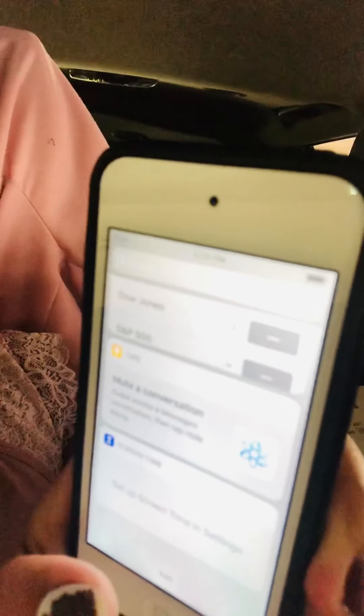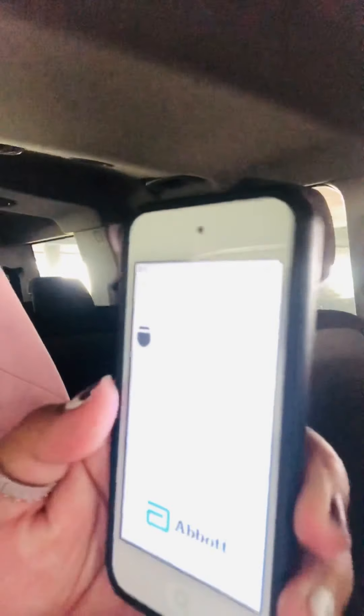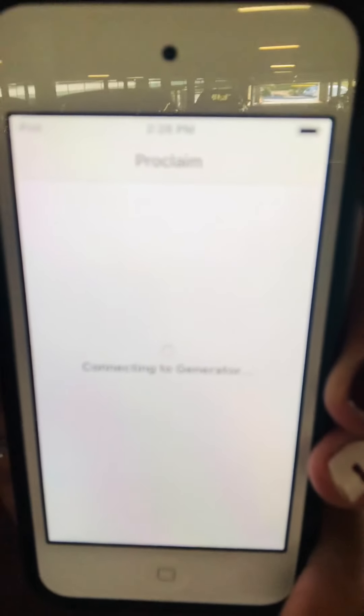Sorry, I need to exit — I'm in the car after just finishing my appointment. So, you press the button on the Proclaim controller. That's my therapy program right there. Once the 10 seconds is done you pair it, and then it takes a little while to connect.